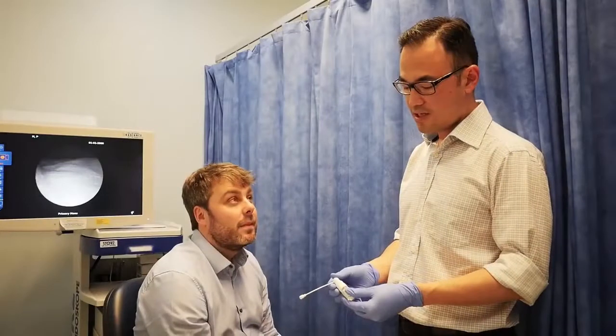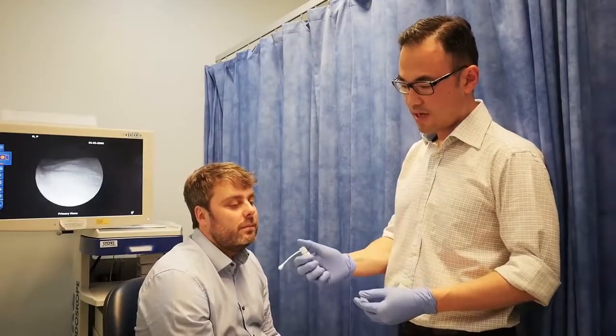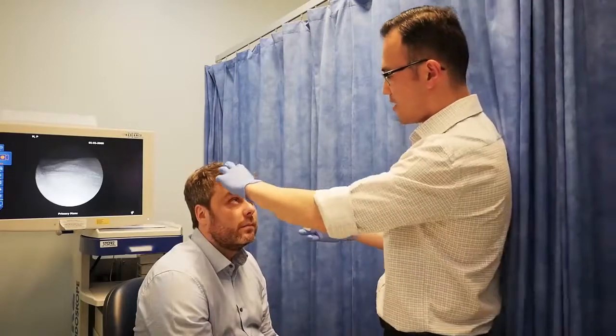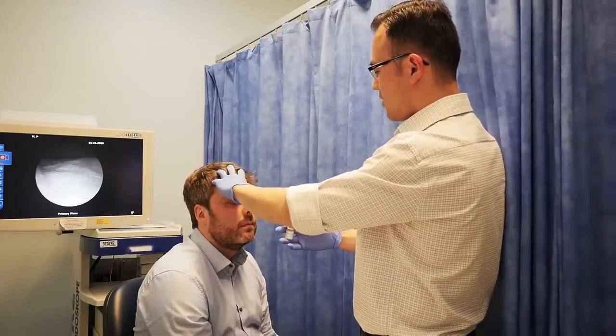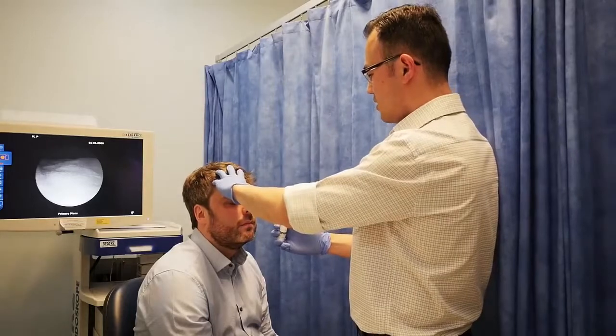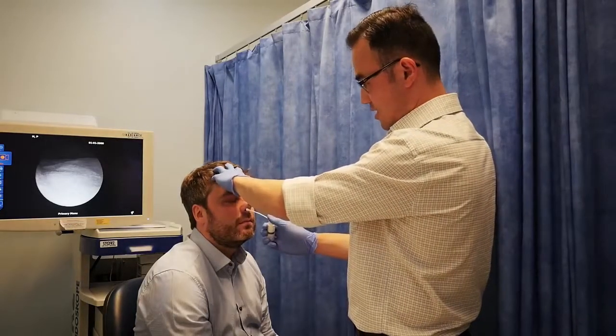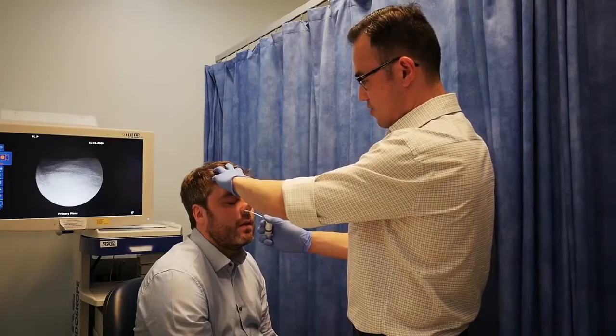So I've attached the nozzle onto the bottle, and I'm just going to prime it by pressing once or twice, and after which I'm just going to apply it to the nose. It's about 2 or 3 puffs each side, okay? Just inserting the nozzle in, 1, 2, 3, and on the other side, 1, 2, 3.